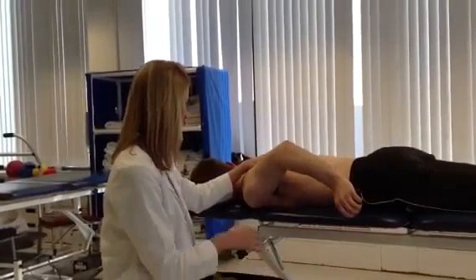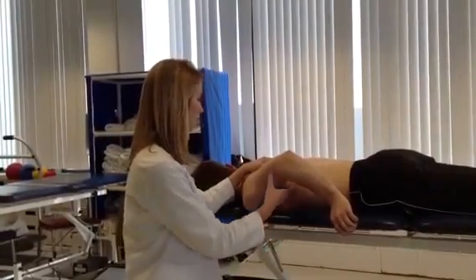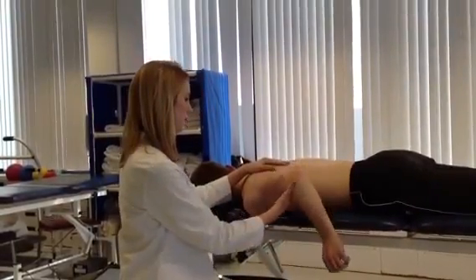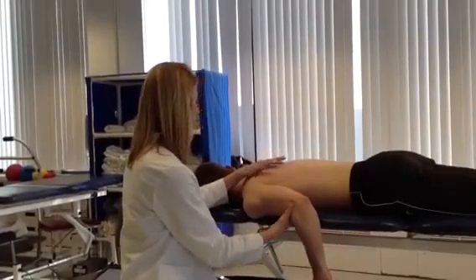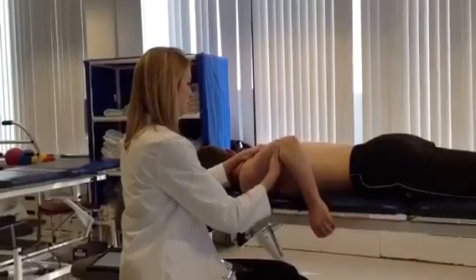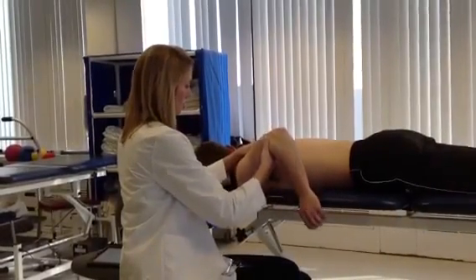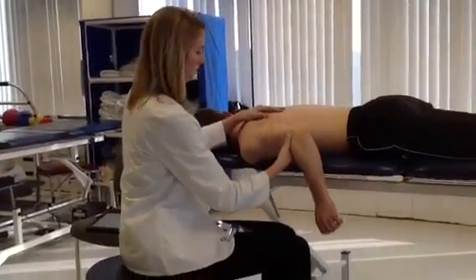Up, and don't let your shoulder come off the table right here. So, good. And now this time if you can just relax into my hand, and I'll go ahead and do the motion for you just to show you the direction I want it to go. So just like that. Alright, until you start to feel tightness.